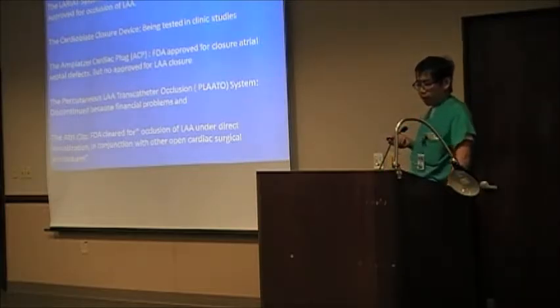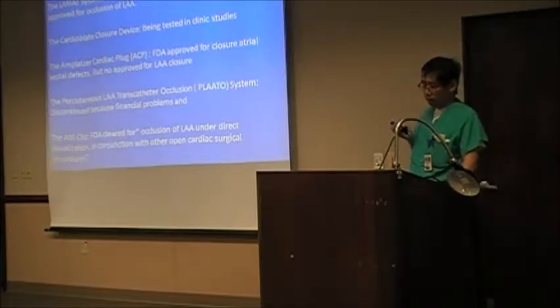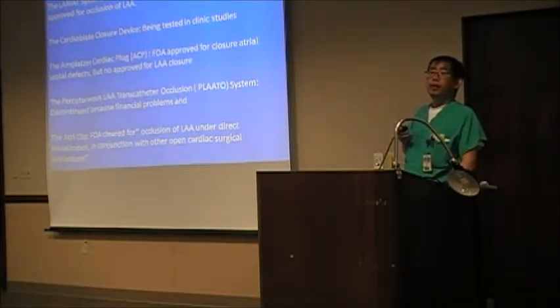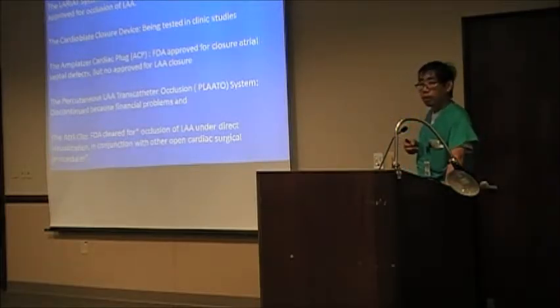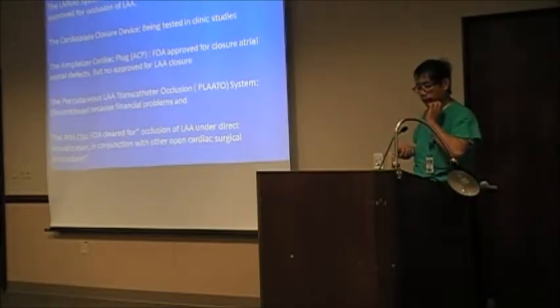I listed a couple of devices used on the market. The first one is Watchman, FDA approved as a left atrial appendage closure device. This is the only device approved by the FDA now. Dr. McKinney, is it FDA approved for only 3 years and then they have to re-evaluate? Mm-hmm. So that means they already passed 1 year. Yeah, there's a reevaluation process. So probably in 2018, right? They have to re-evaluate whether the risk is acceptable or not.